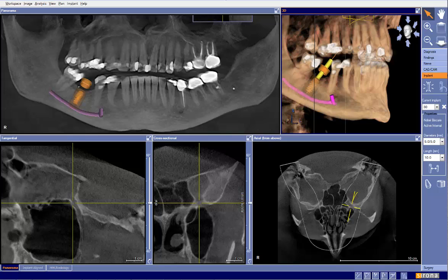So when we get these particular scans in for evaluation, we go through a few more processes and steps because there are typically a few more things that need to be done. This patient is missing tooth number 30 and we'd like to place an implant there. The implant plan has come to me with the implant in place, with the sleeve in place, with the nerve mapped out, which is fantastic.